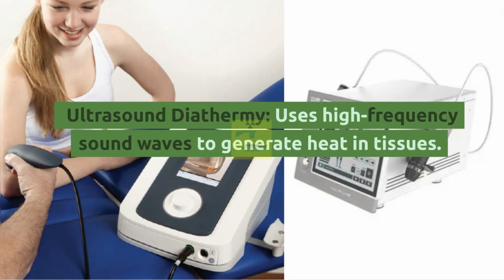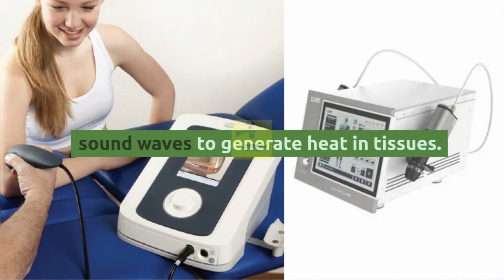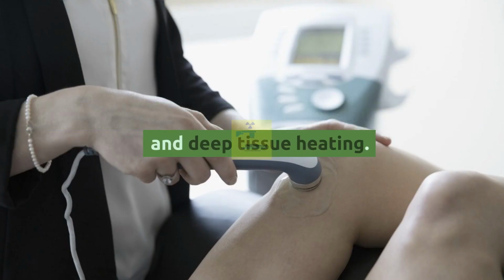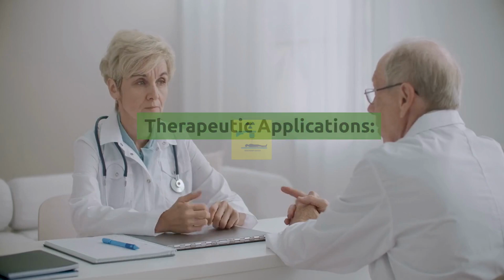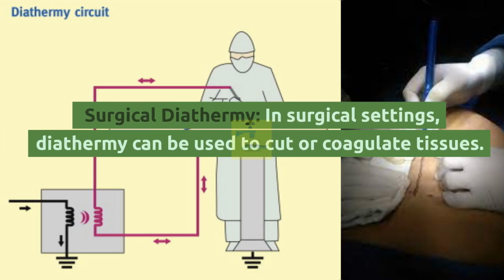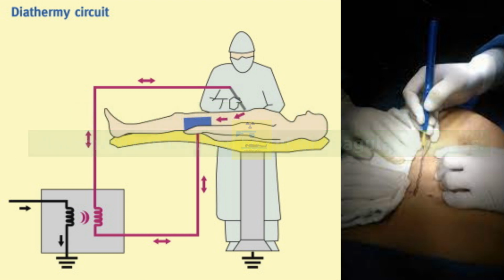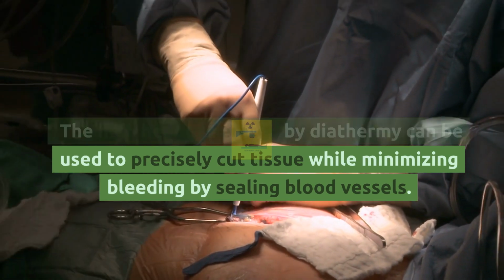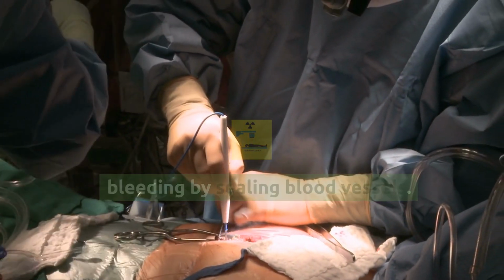Ultrasound diathermy uses high-frequency sound waves to generate heat in tissues. It's often used for musculoskeletal conditions and deep tissue heating. Therapeutic applications. Surgical diathermy. In surgical settings, diathermy can be used to cut or coagulate tissues. The high heat generated by diathermy can be used to precisely cut tissue while minimizing bleeding by sealing blood vessels.